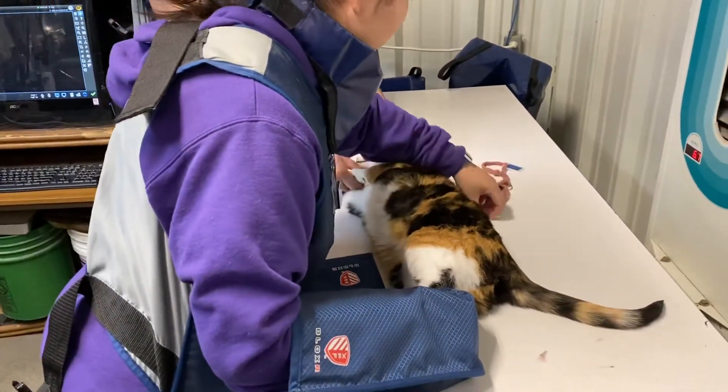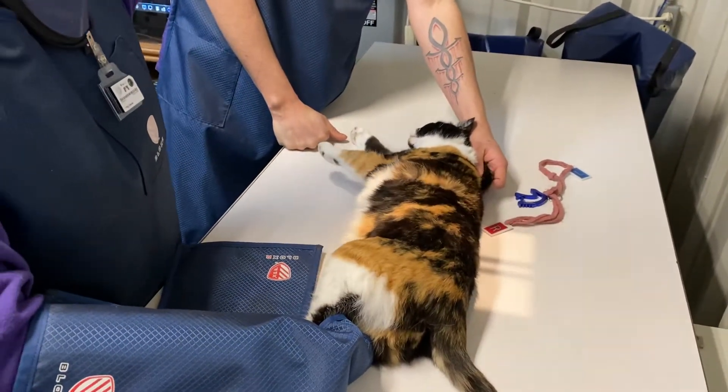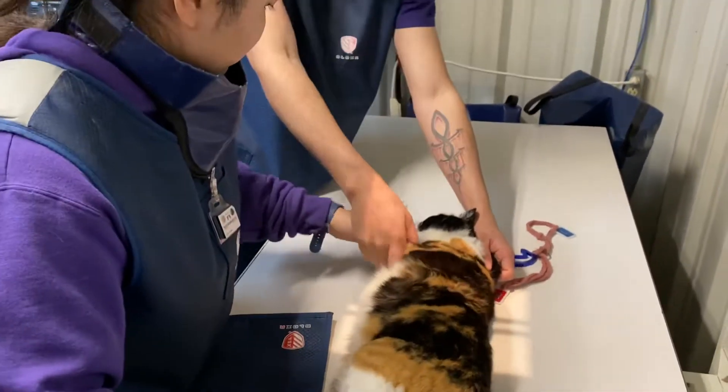She's on her right side, so I'm going to have that marker in. I'll go ahead and narrow the field a little bit, and we're going to scoot her down so we can get that chest part going around her feet.